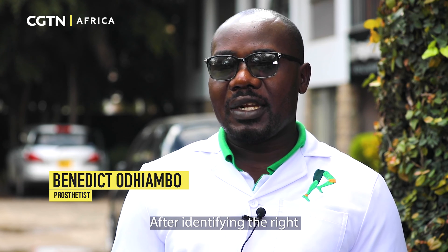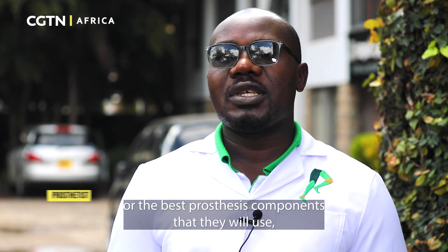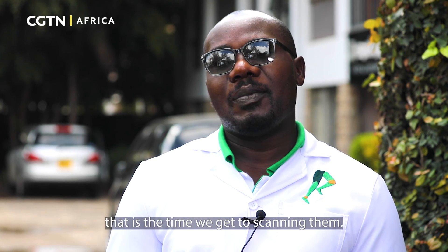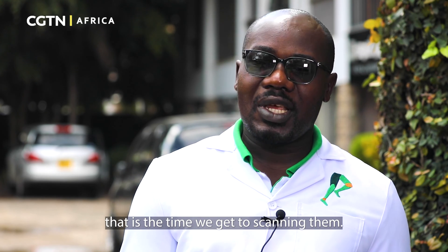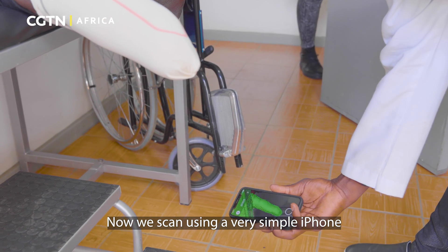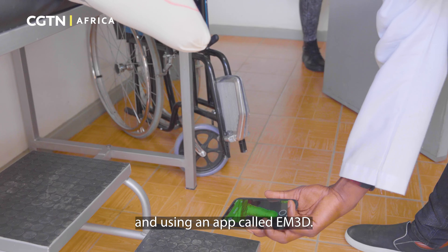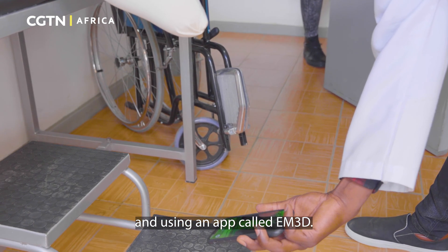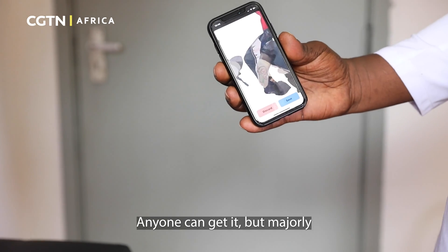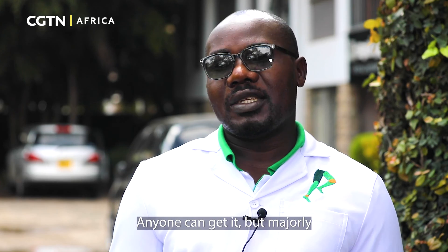After identifying the right or the best prosthesis components that they will use, that is the time we get to scanning them. We scan using a very simple iPhone and an app called EM3D. It is an open source app — anyone can get it, but mainly just on iPhones.